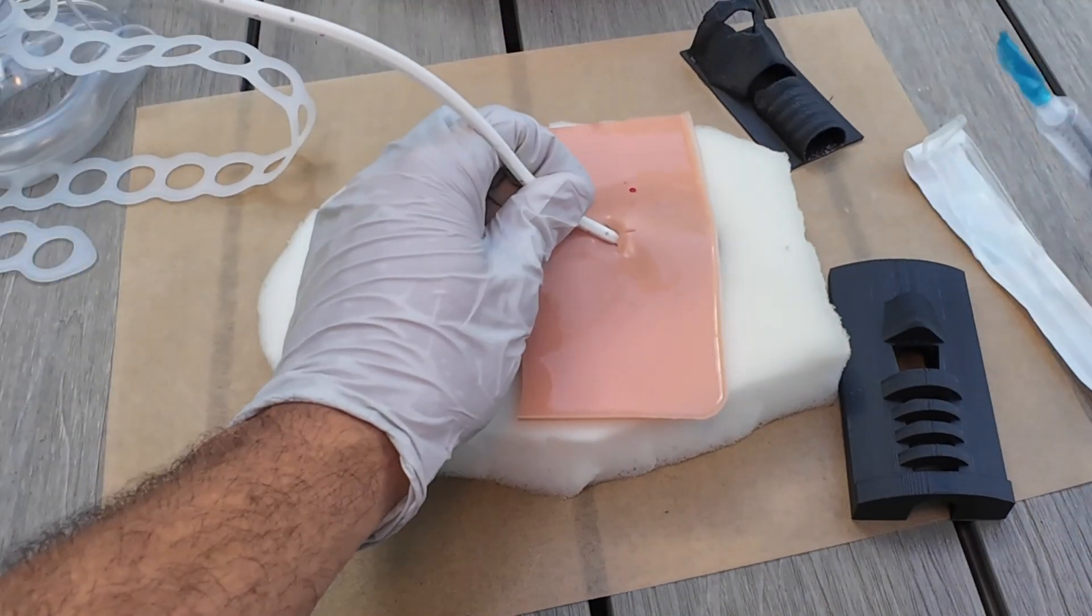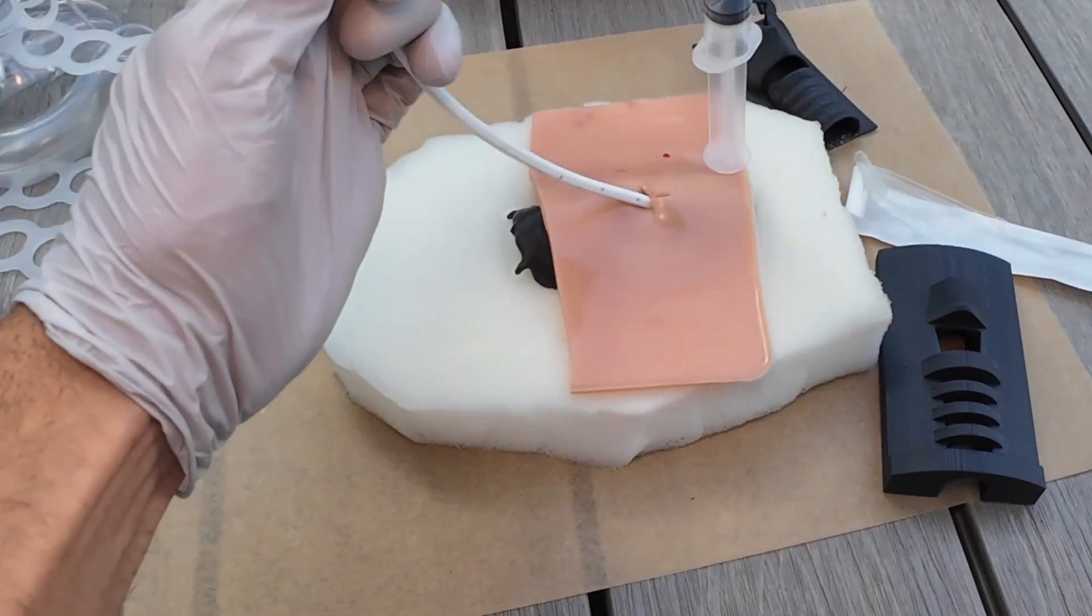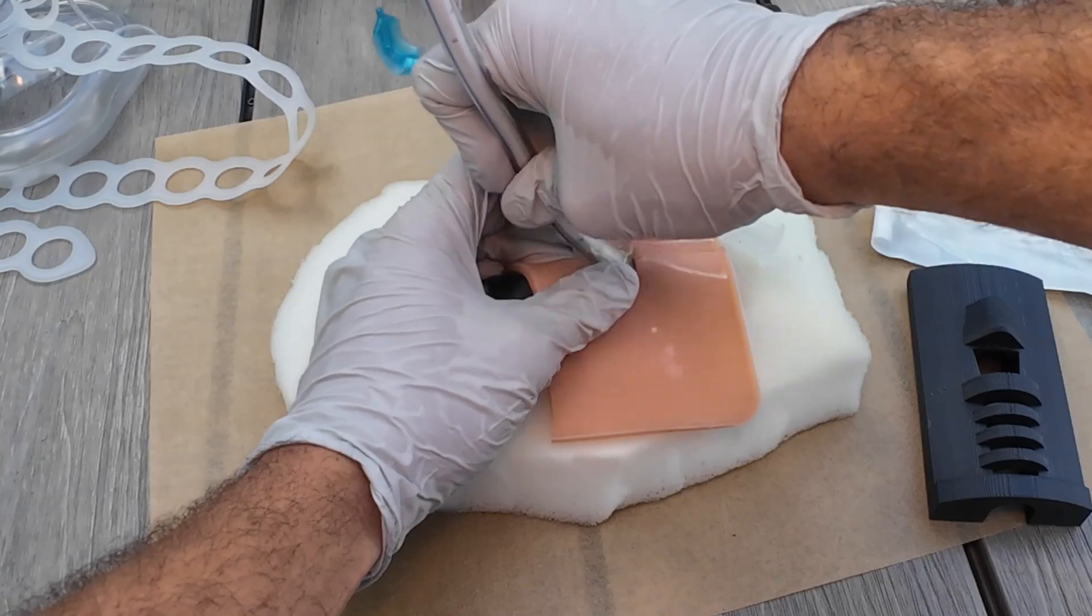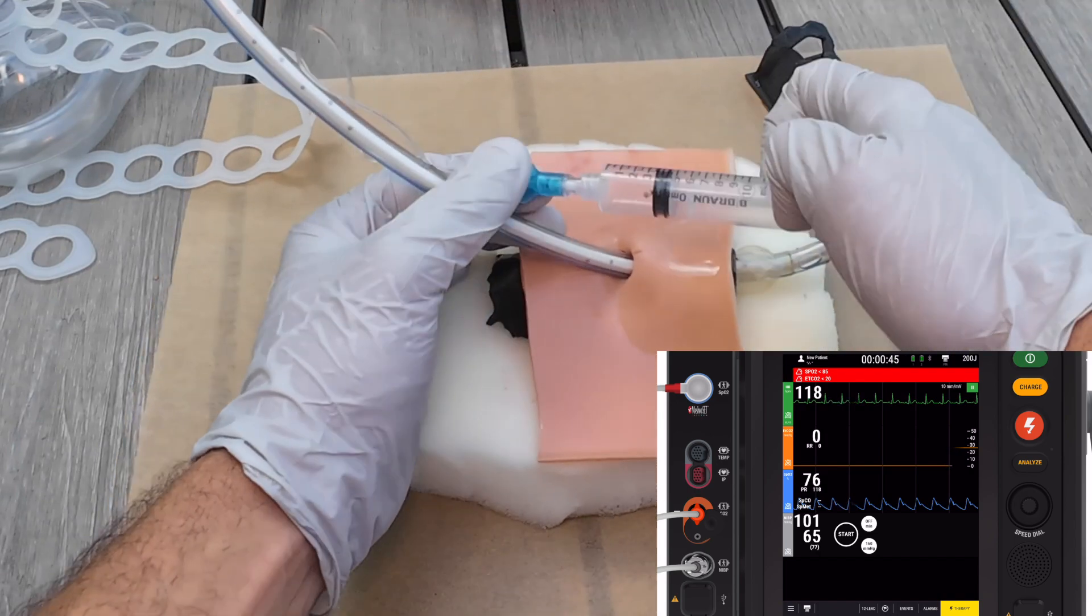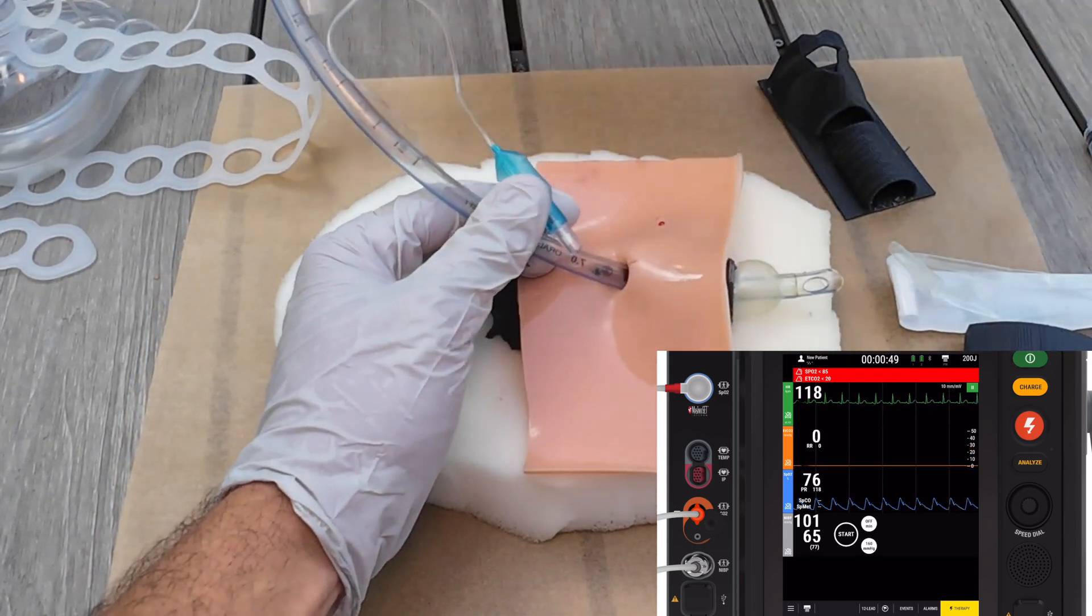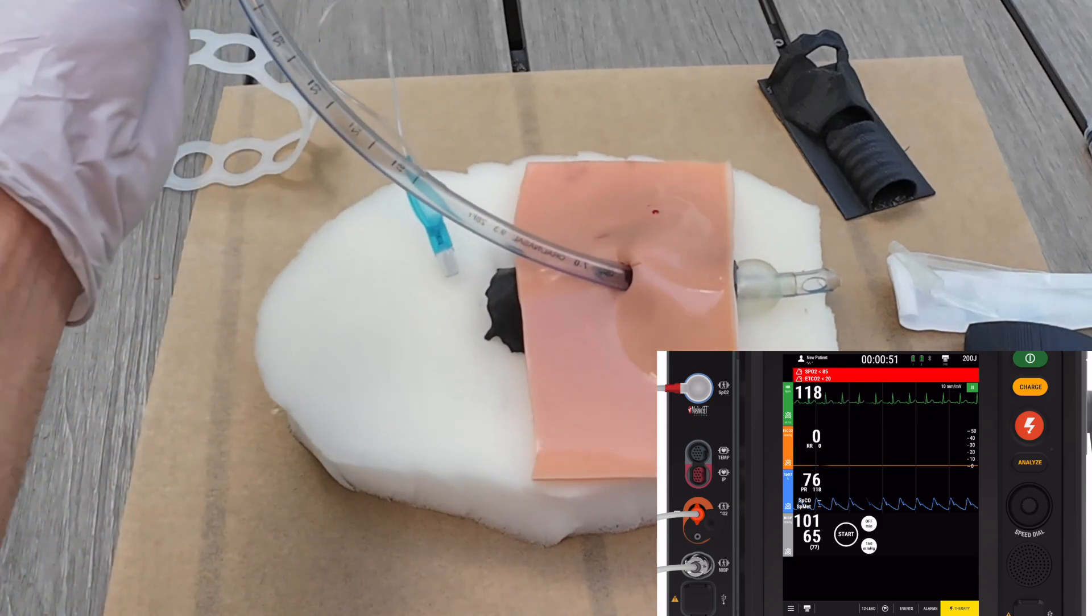Guide it over my bougie. If you have a partner, you would hold the bougie. Maintain that. Place the tube through. Tube through until the line's gone. Fill your pilot. And bag your patient. Using capnography.